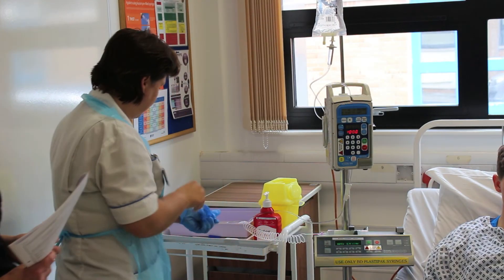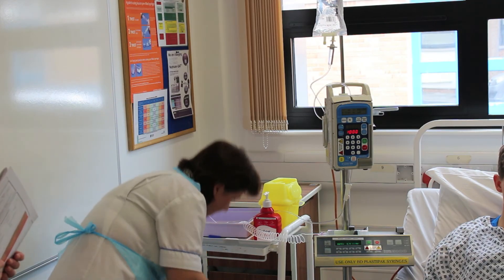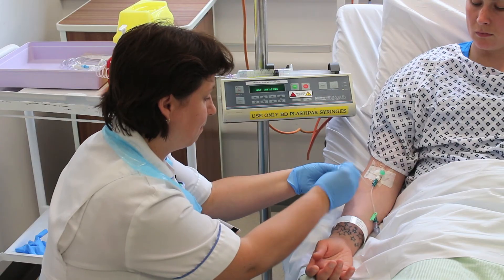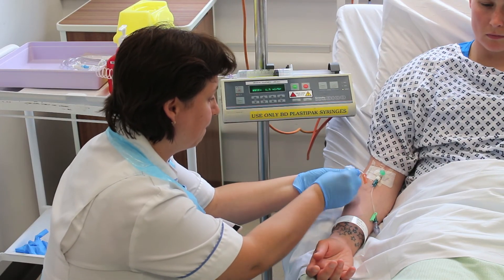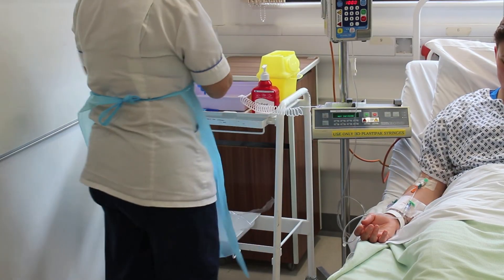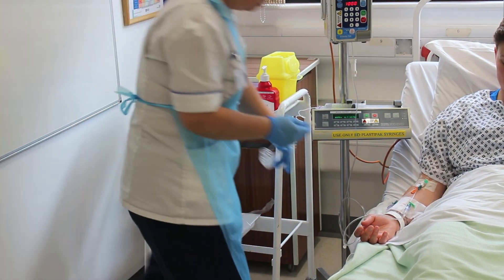You should now decontaminate your hands and put on clean gloves before you touch the patient. Use your disinfectant wipes to clean each port separately and let them dry before connecting one to the insulin infusion line and the other to the IV fluids.